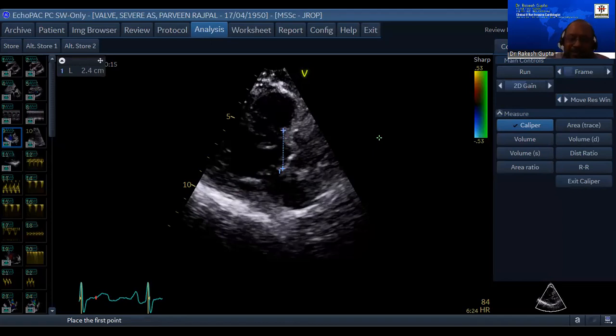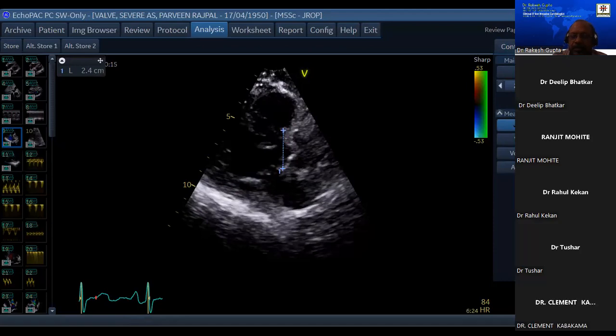So we've got three variables. One variable is LVOT diameter. Second variable is LVOT VTI. Third variable is aortic valve VTI. Is that clear? Yes, sir. So how do you do it now? Then let the next person come up and tell me.